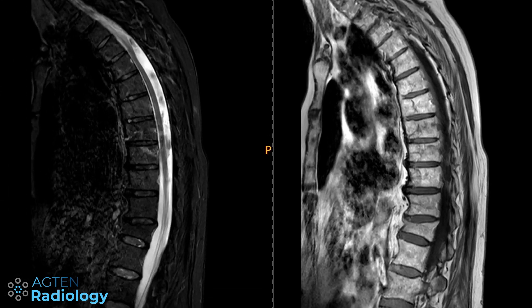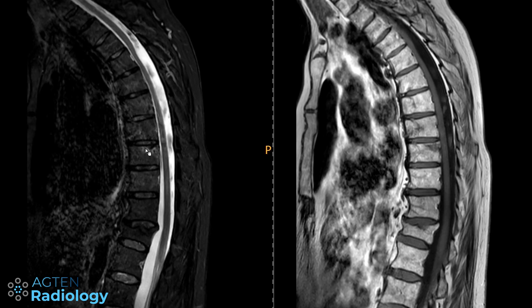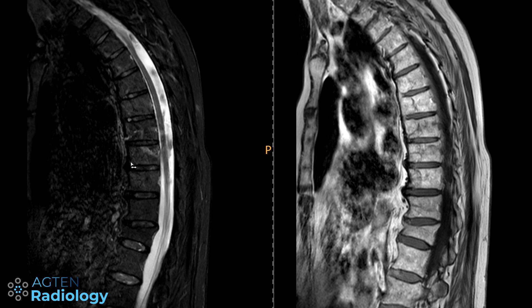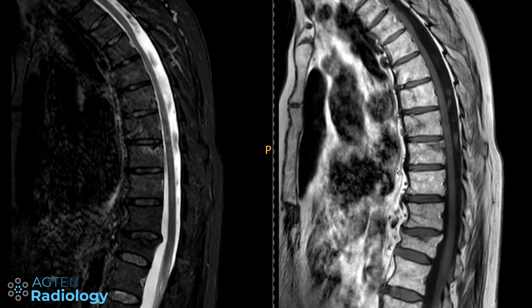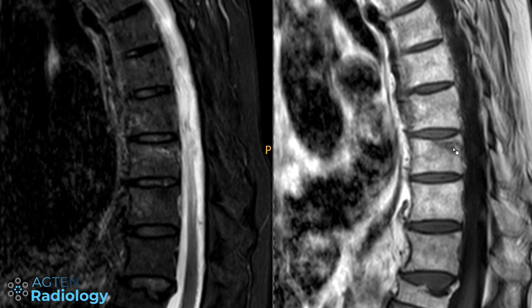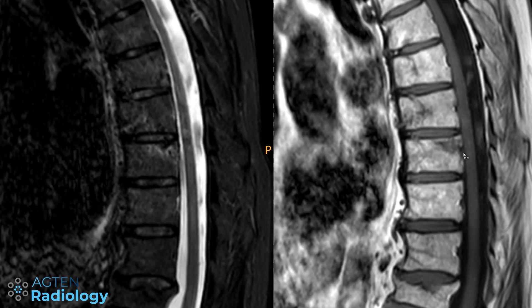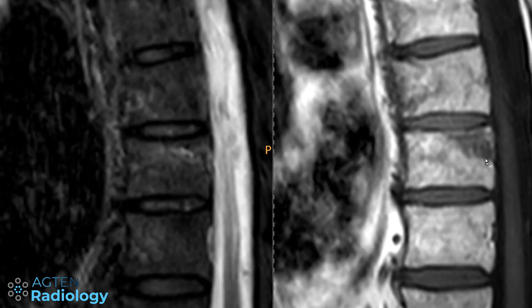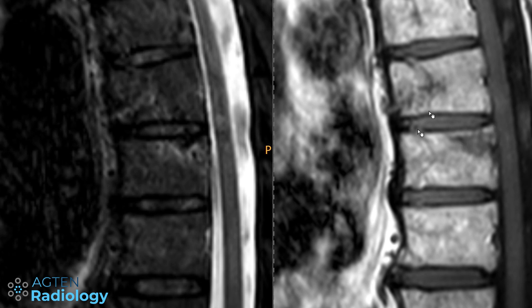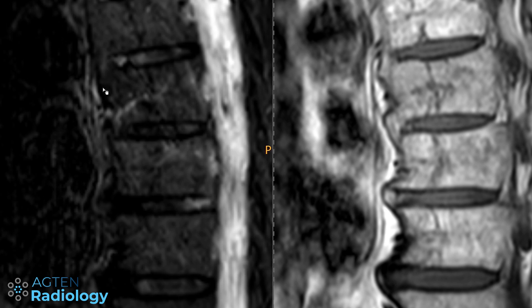At first glance if you just scroll through, you might think this is just some small incidental change. You could easily forego calling this a fracture, especially without the CT scan for correlation. On the T1 sequence, there is a subtle linear change within the vertebral body at TH9 — very subtle. We don't lose any height at all, there's no epidural hematoma, no significant paravertebral edema — just this tiny amount of fluid at the level where the DISH formations broke.